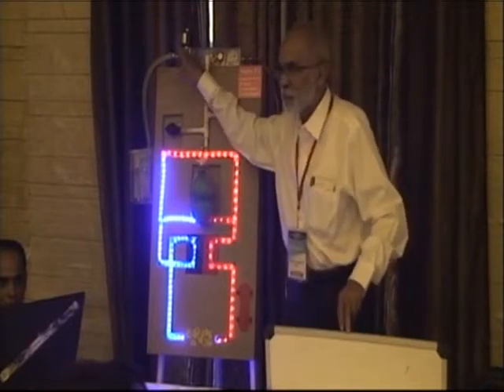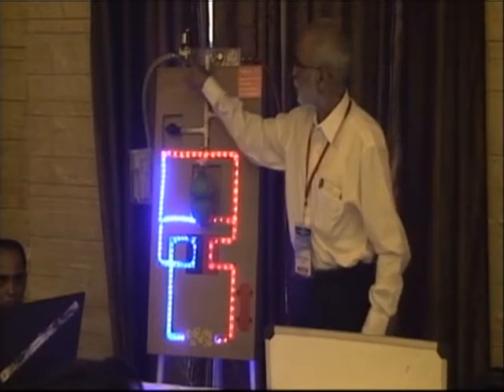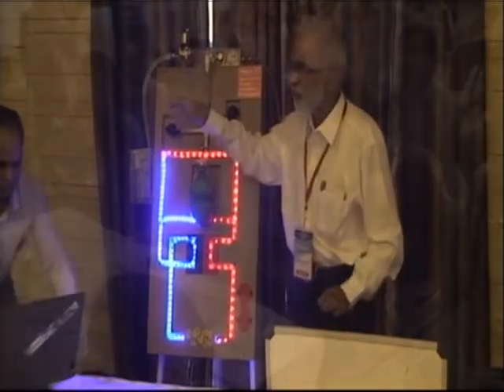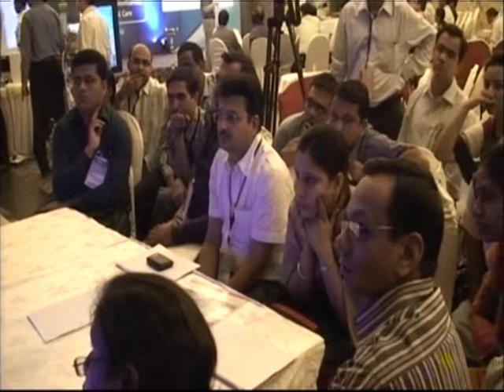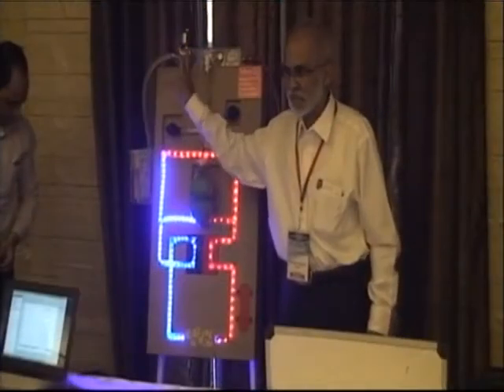And we have a solenoid valve. You must have heard of these valves in most latest ventilators. This solenoid valve is electronically operated. Okay? And now I have given an I:E ratio of 1:4. Okay? 1:4 ratio. That's an I:E ratio I've given here. I can change that ratio or I can change the rate of this flow.